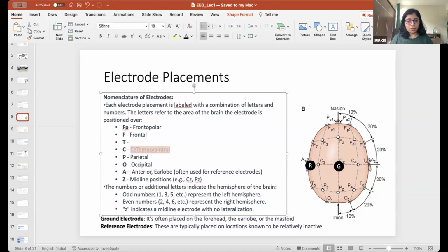Central, sorry, then parietal. When we were placing those electrodes, you mentioned there is one electrode we put at the center of the forehead, in line with this. Maybe that is reference or ground, I don't remember. So that is to align the cap. If you want to know where exactly to put the cap, generally take the distance from the nasion bone to this. Nitesh will know better about that, he's done it more. For a particular cap, it will be mentioned how exactly to measure it so that everything is in the right place.